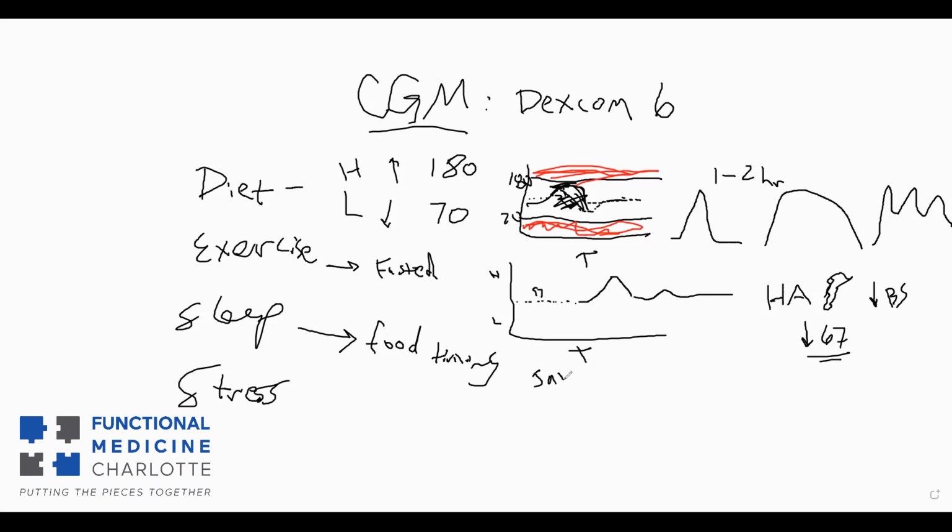and then I helped Kate put the kids to bed, and then probably 40 minutes later, I had gluten-free pizza. It was like 9:47, I believe. I can look on my monitor for when I ate the pizza. And so I ate the pizza and went to bed, which, you know, is too late to eat and go to bed. But life got me that night. And so in the morning, I looked at it, and what the blood sugar looked like was this.